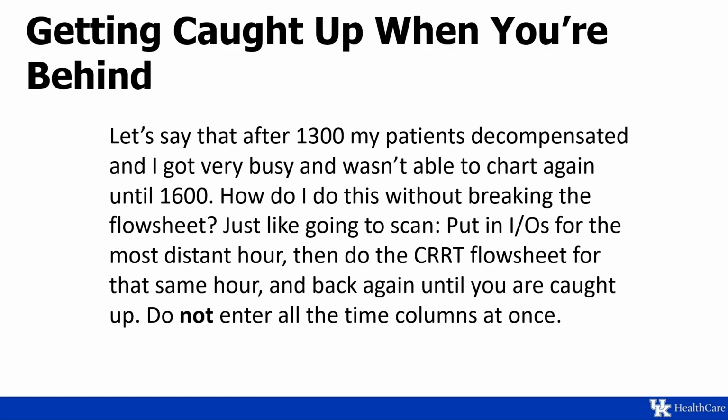So kind of in the same vein, let's talk about getting caught up when you've been behind on charting. It is 1 o'clock and my patients got really sick and I got super busy and I wasn't able to chart again until 4 p.m. How can we do this without breaking the flow sheet?